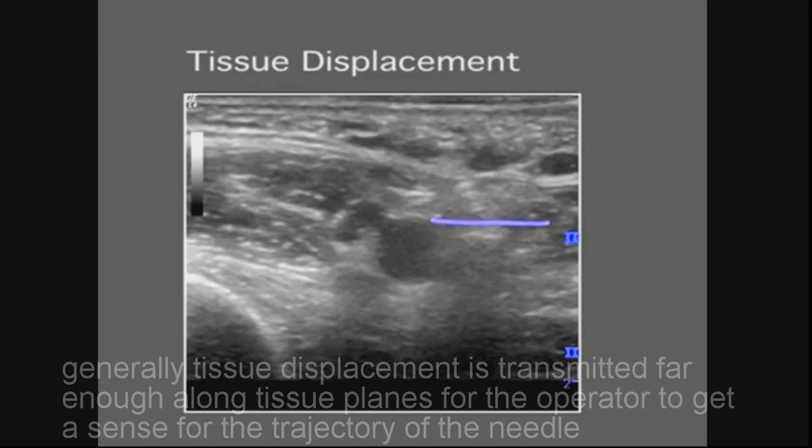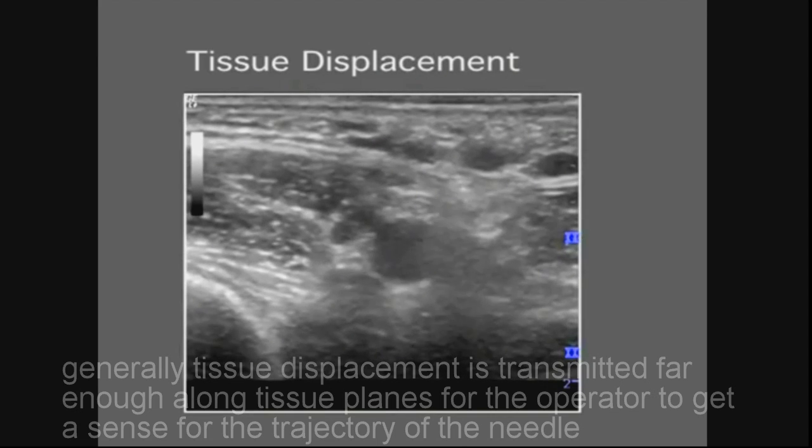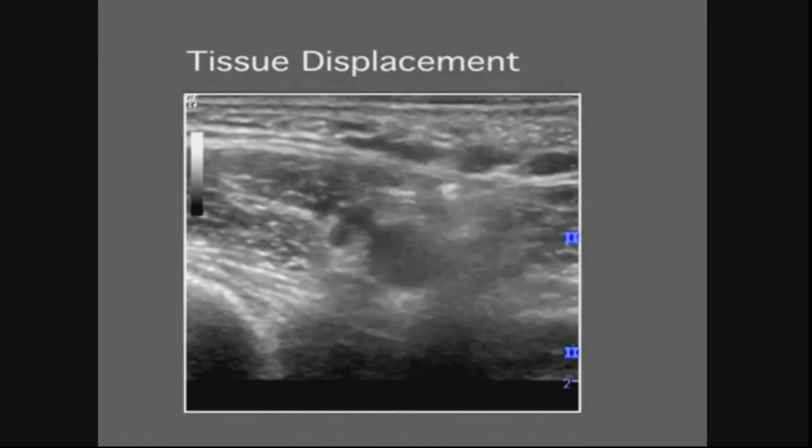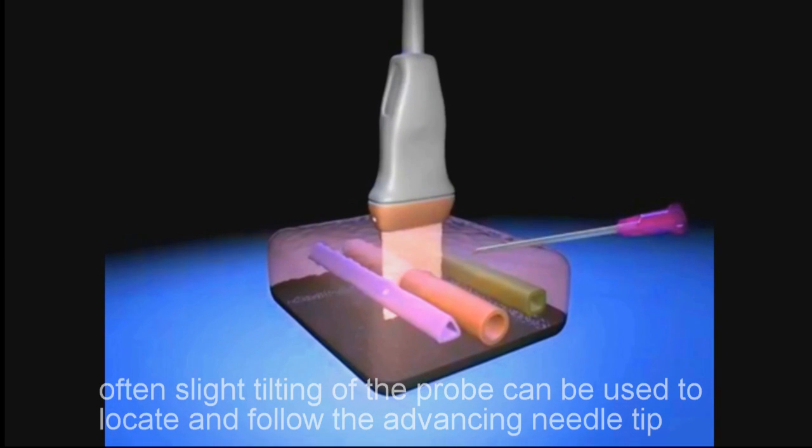Generally, tissue displacement is transmitted far enough along tissue planes for the operator to get a sense for the trajectory of the needle. Often, slight tilting of the probe can be used to locate and follow the advancing needle tip.